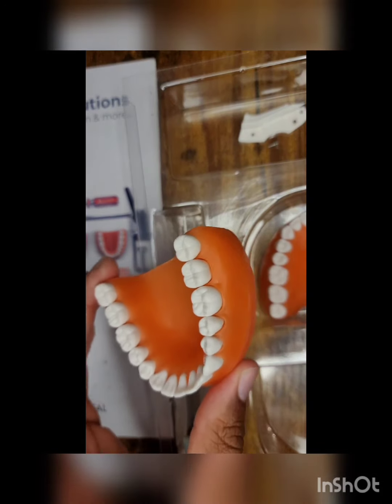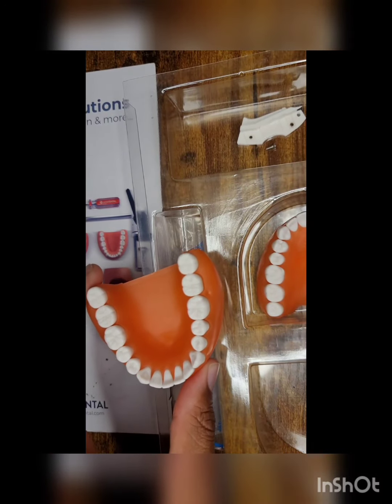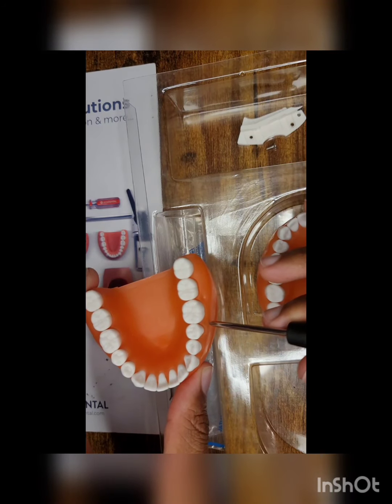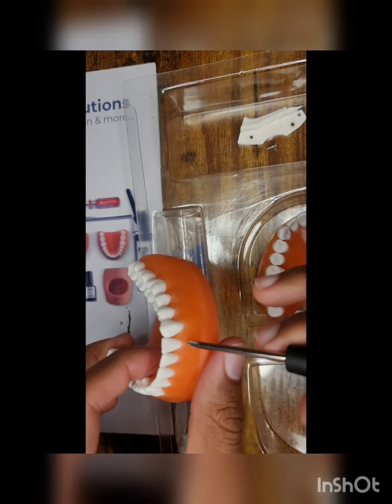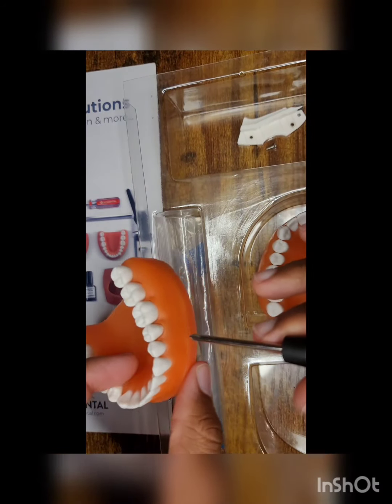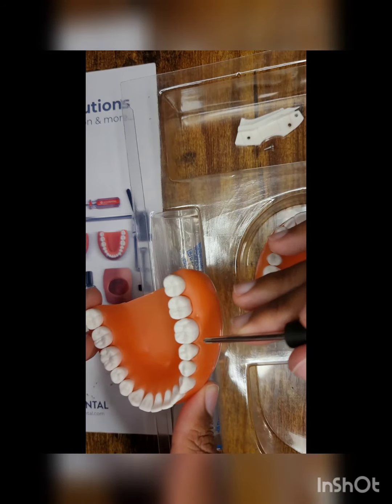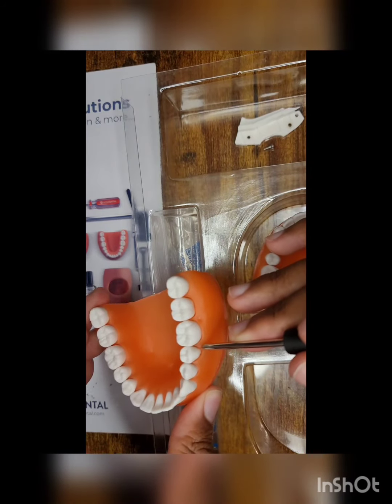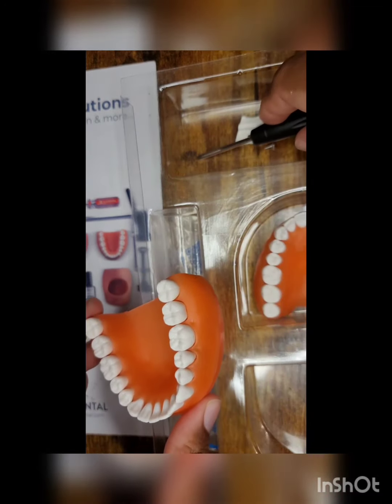Here is the mandibular typodont. This is what you would be working on for the actual exam — either lower left or lower right. For my mock board exam I used the lower left. You can see the issue with that is that it actually expanded the gingiva. So that's the one issue I would say about this unit: once you actually start working on it, it's going to show, and if you work on it for tons and tons of practice, it's going to get stretched out.